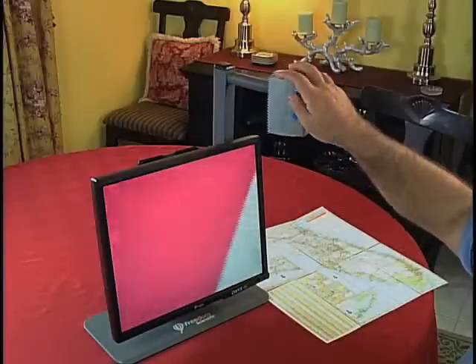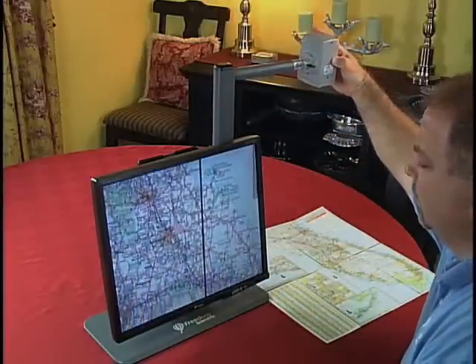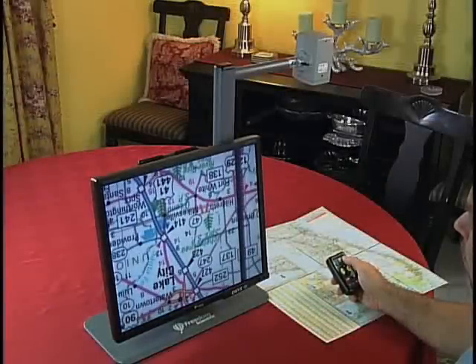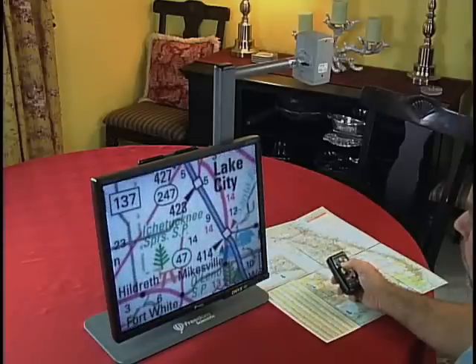When I work with big documents like maps, I can get more room by swinging the camera out to the side. It doesn't matter how I position the camera because a simple button push can flip the image so that it's right side up.